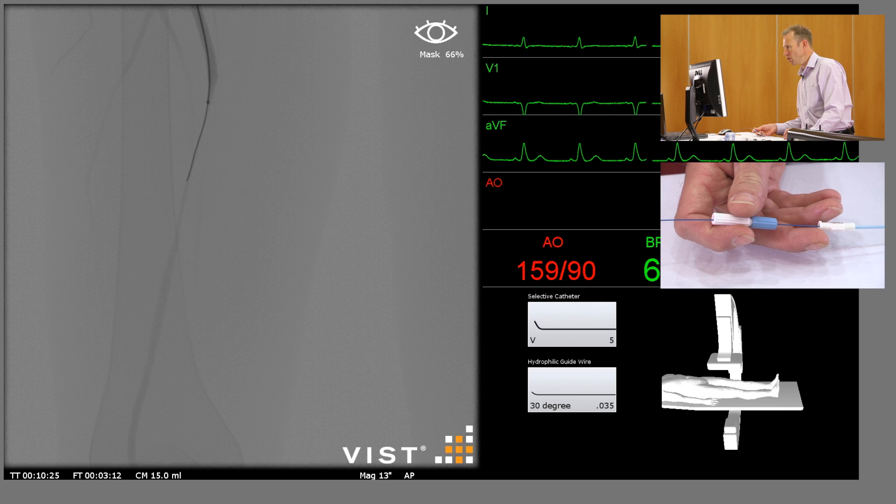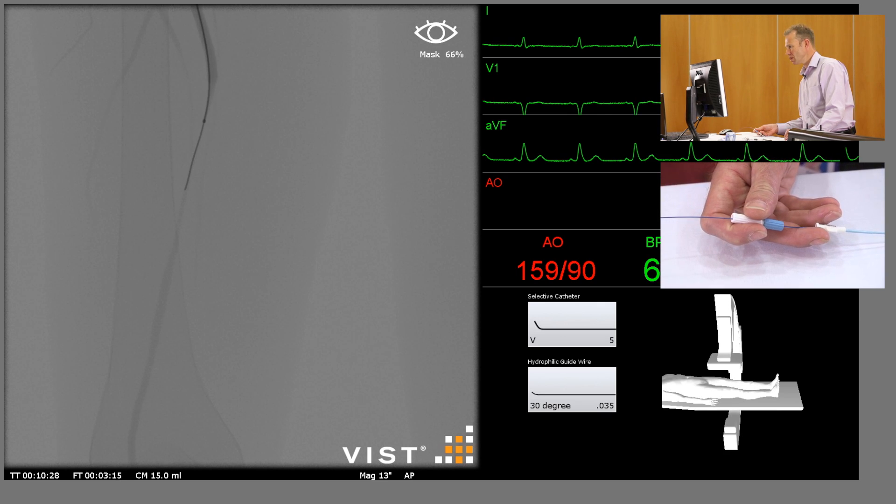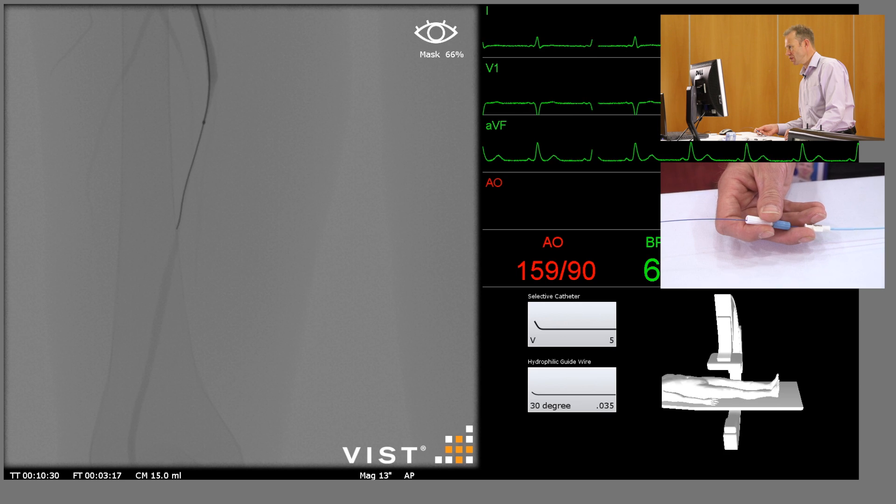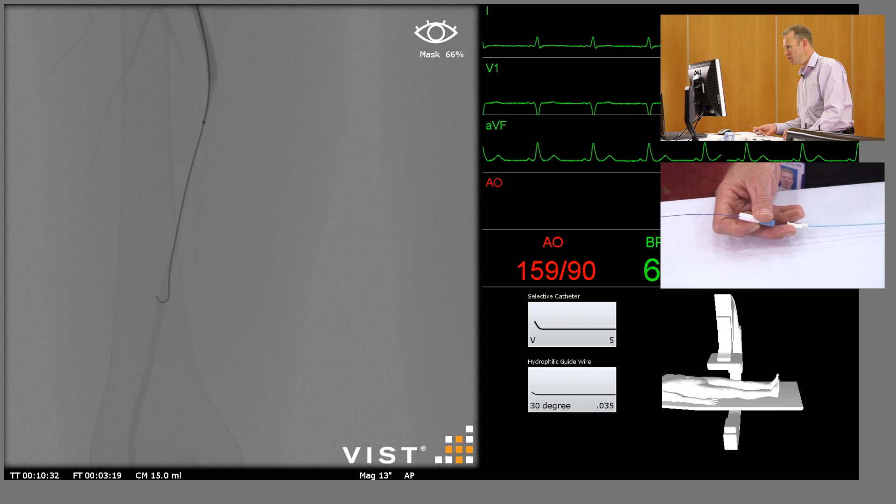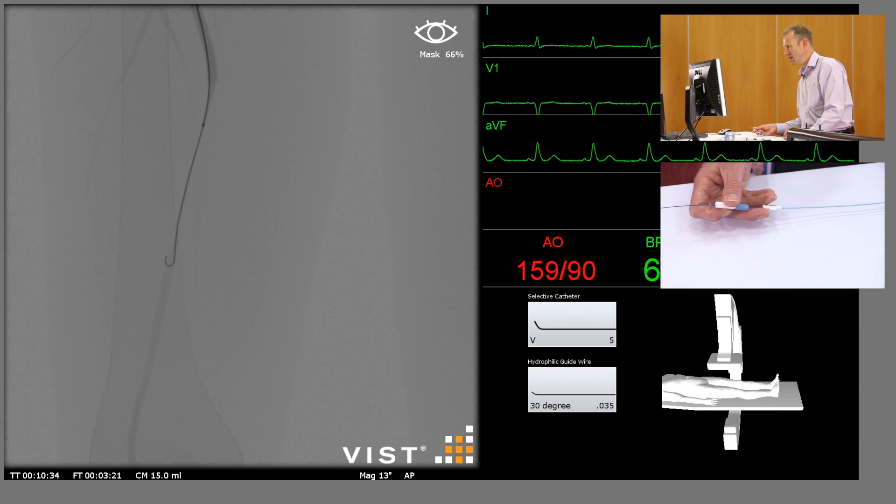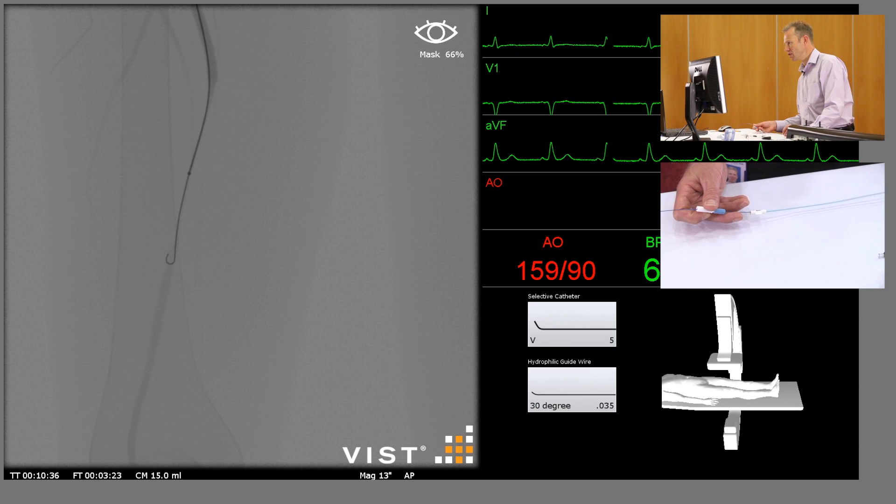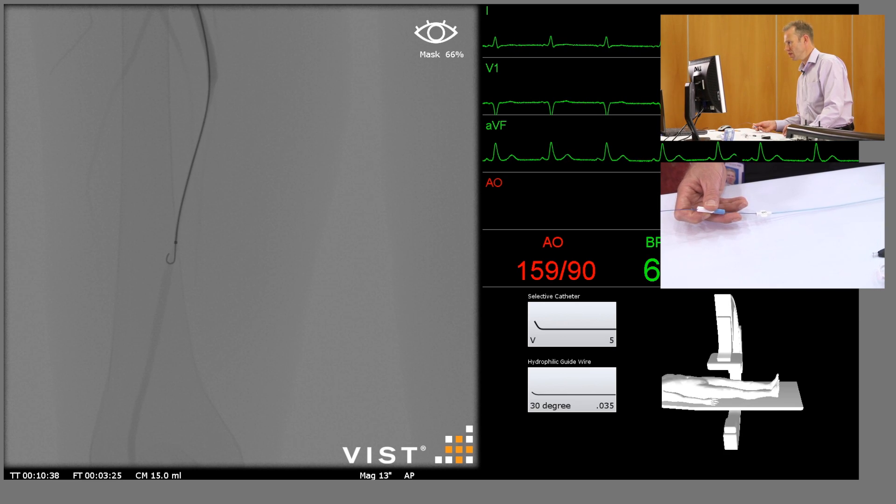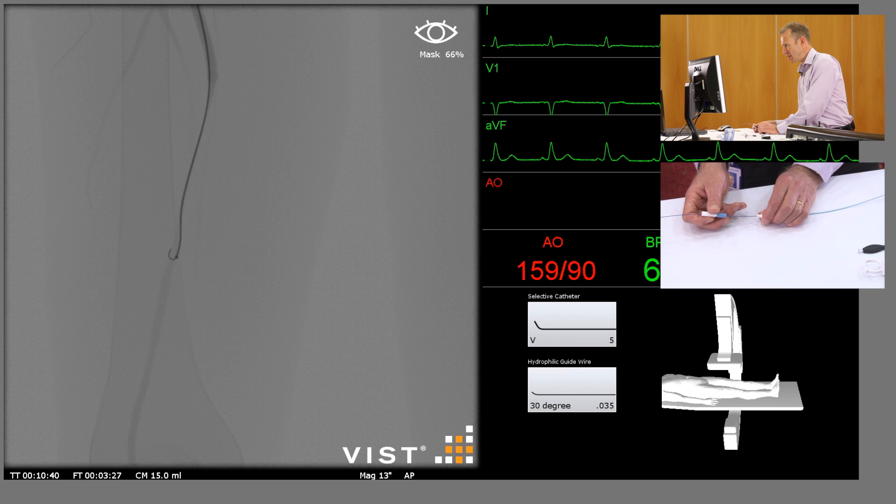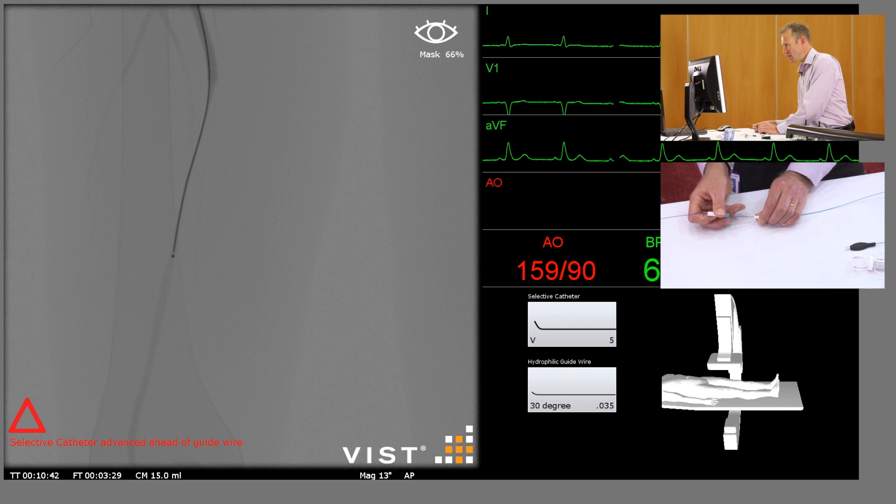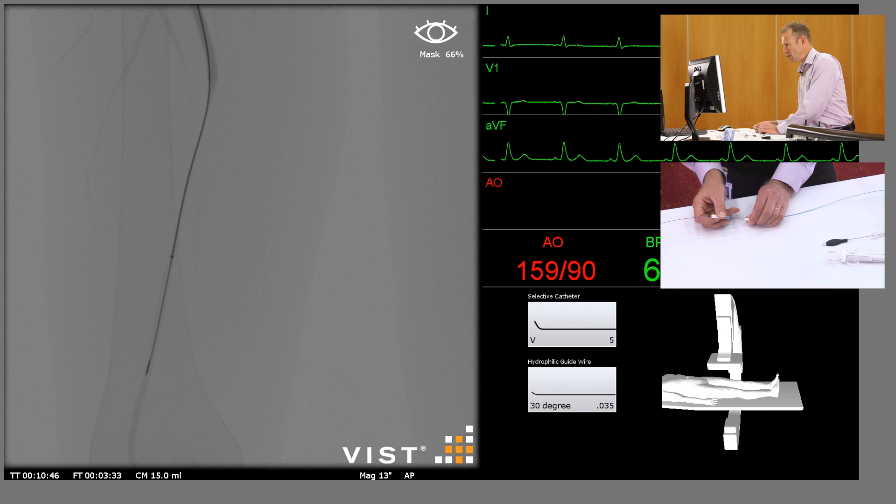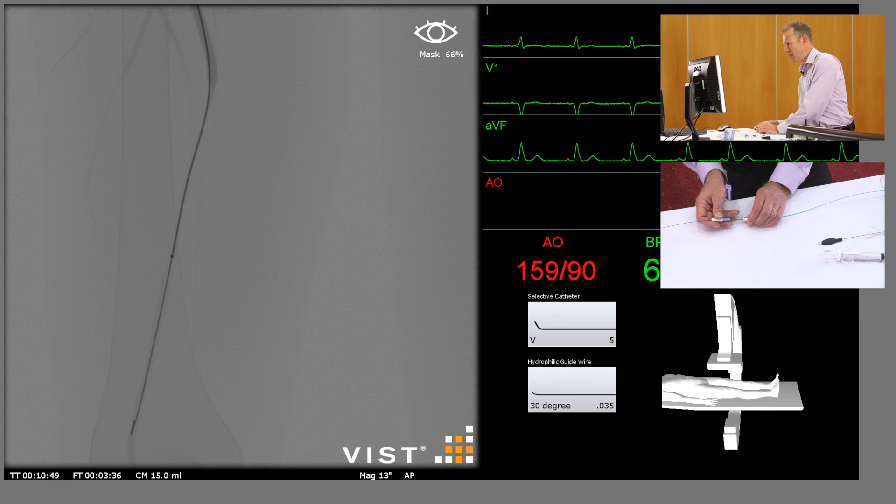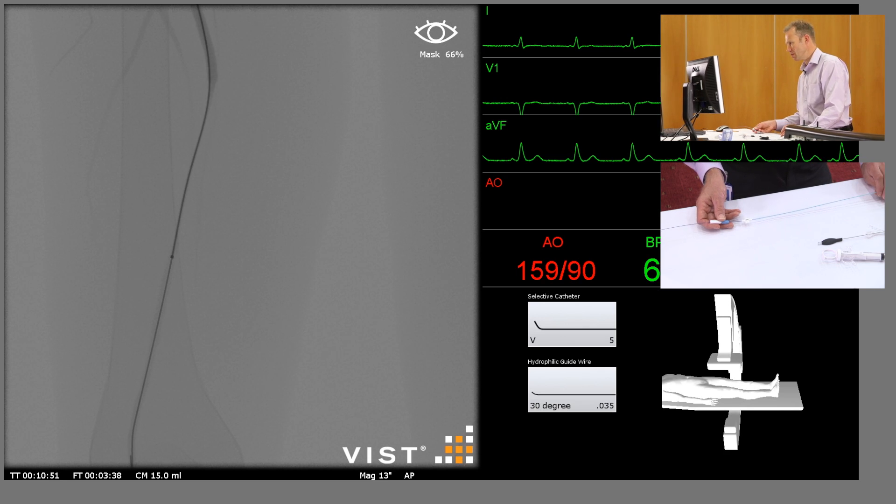Now I'm just following down with the catheter to give it some more support and advancing the guide wire further. It's going very easily at this point until there, so I'm going to take the catheter down to there to give it some more support. I'm just going to withdraw the wire back into the catheter to straighten it out and now advance it gently through the center of the stenosis. We've got a little loop in the wire but it's a hydrophilic wire and it's going very easily, and I'm happy that that's still intraluminal.